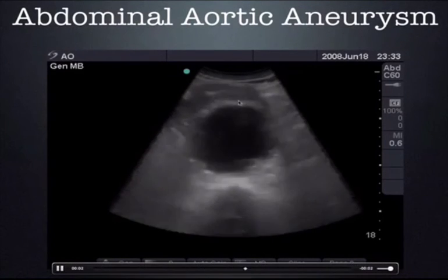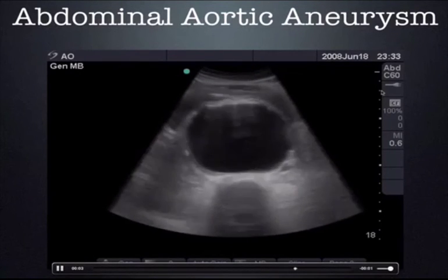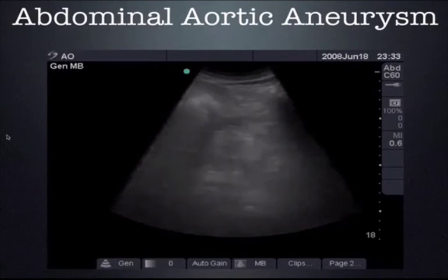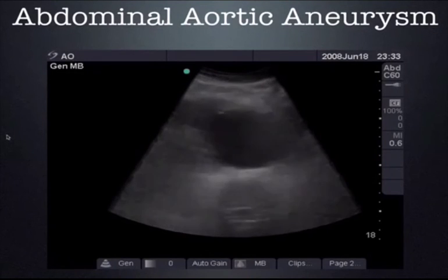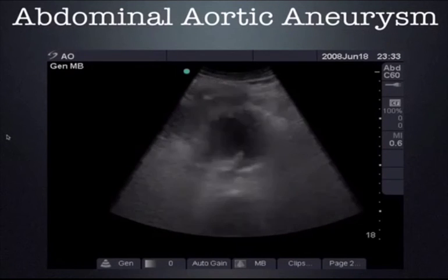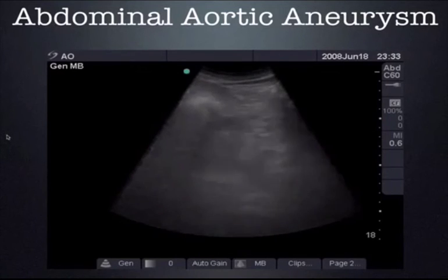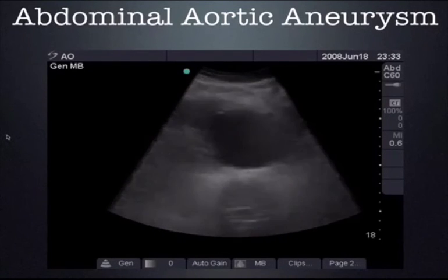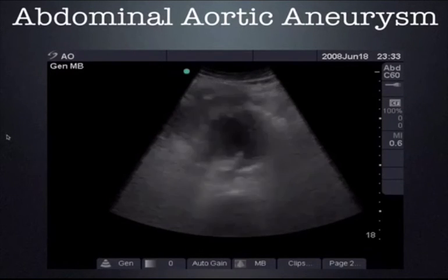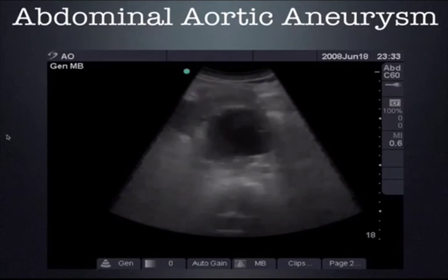The abdominal aortic aneurysm, the most anterior surface of it, is only about 2 to 3 centimeters deep under the skin. So most large aortic aneurysms, even though bowel gas and body habitus are major limiters, if there is a large aortic aneurysm, oftentimes it'll reveal itself to you with minimal pressure. Now, I'm certainly not suggesting that if you cannot see the abdominal aorta, you can then therefore rule out aortic aneurysm. Not saying that at all. I'm just saying most of the time, if there is an aortic aneurysm, it will reveal itself.